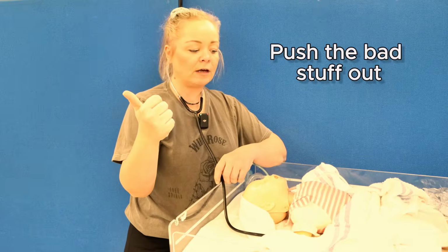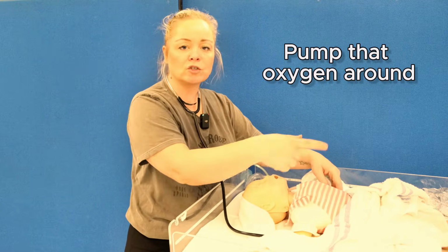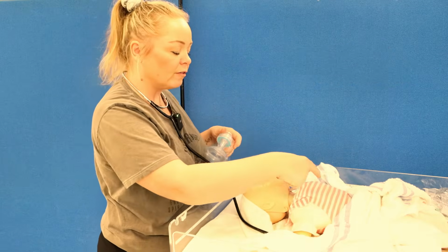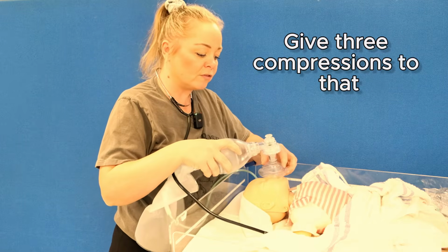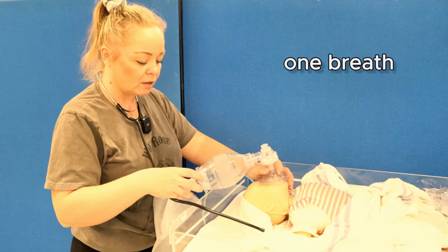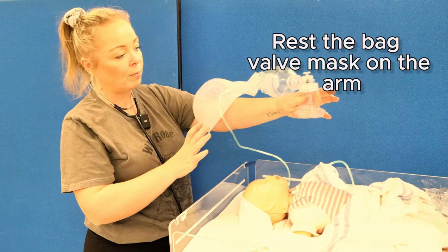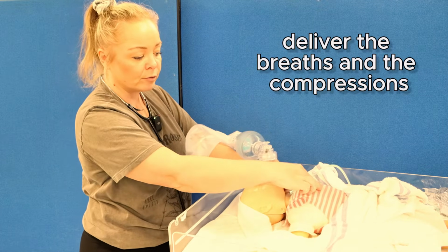I've pushed the bad stuff out. I've put some good stuff in, some more oxygen, and now I'm going to pump that oxygen around. The ratio for the infant, because they've got a very small space to go from the heart to the lungs, so we've only got to give 3 compressions to that 1 breath. If I'm on my own still and help still hasn't arrived, I can rest the bag valve mask on my arm, like this, and deliver the breaths and the compressions.